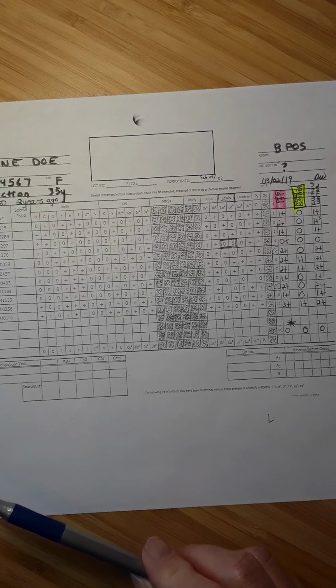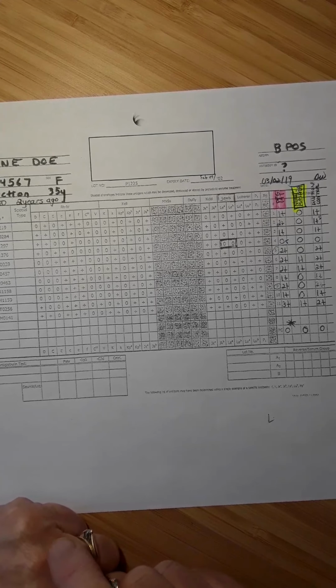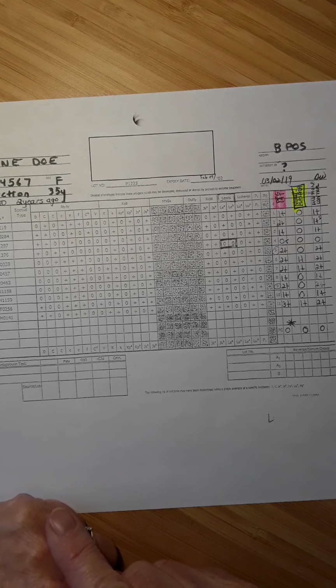So you add that to the patient's plasma that apparently contains the anti-Lewis A and the anti-Lewis B, and those antibodies will bind to these soluble Lewis antigens in the neutralizing substance, and these antibodies will be neutralized. They'll be bound to the soluble antigen and they will no longer be able to react with panel cells. So we set up the panel again with the neutralized plasma.